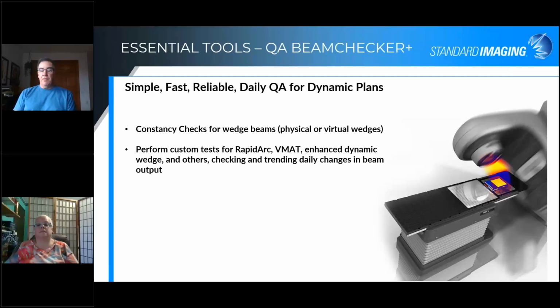Different from the static measurements, you actually take a CT study of the device and the chamber array on the device. You bring that into the treatment planning system. You basically build a plan around those chambers, deliver that plan. That becomes your baseline, and then on a daily basis, you can deliver that specific plan and get those specific results as well. So you get output constancy for all the chambers on the unit. Great. So that sounds great, and that's still a traditional Elekta Varian C-arm Linac.